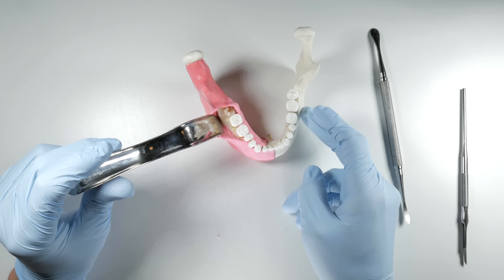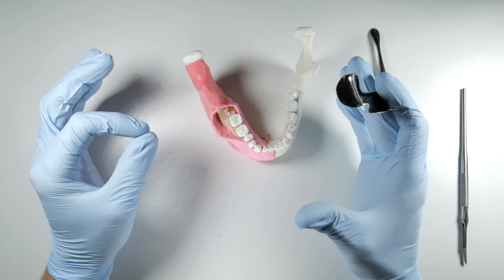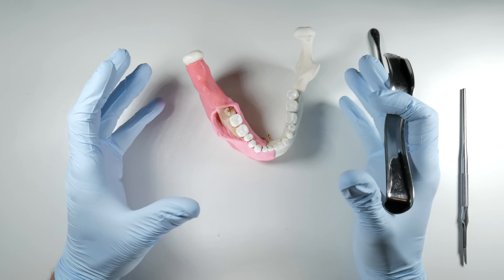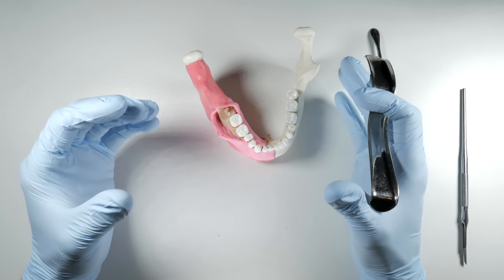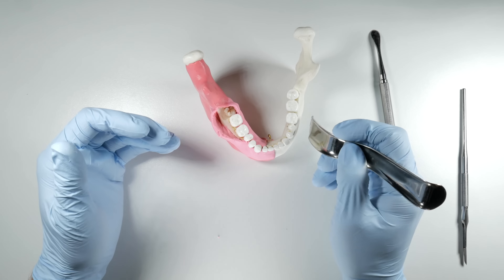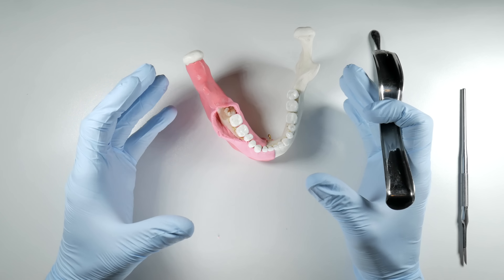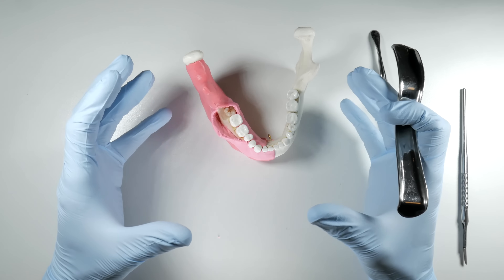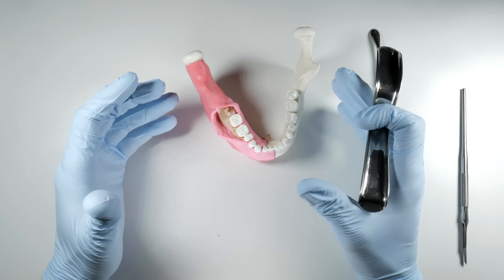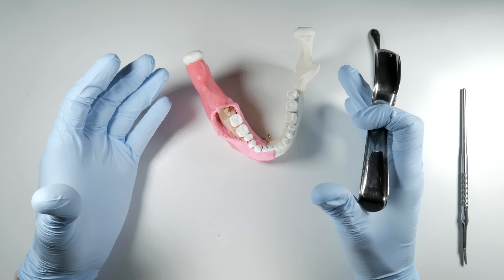What happens if we reflect too far beyond the external oblique ridge? You'll be opening up what's called physiologic dead space — basically a pocket that didn't need to be open, dissecting through a fascial plane. This opens a space for hematomas to form, meaning blood pooling into an empty space, or a seroma — a collection of blood plasma and inflammatory fluids. Your edema will be greater, you'll have a larger area collecting stagnant, contaminated fluid, and that is a recipe for infection.